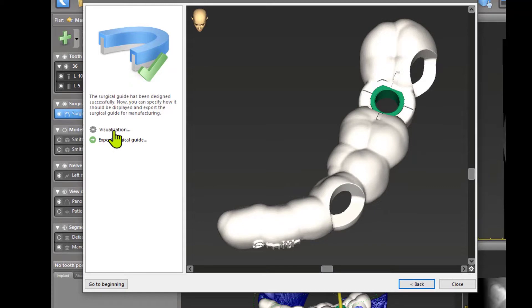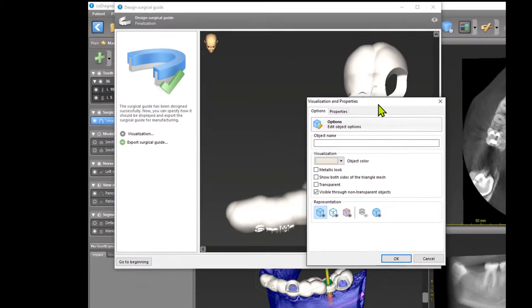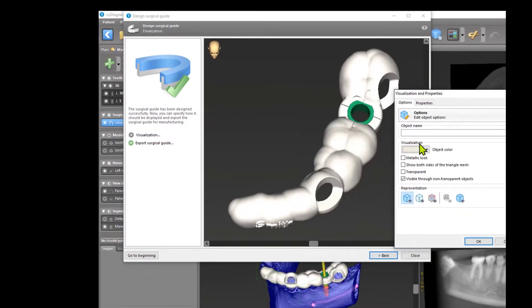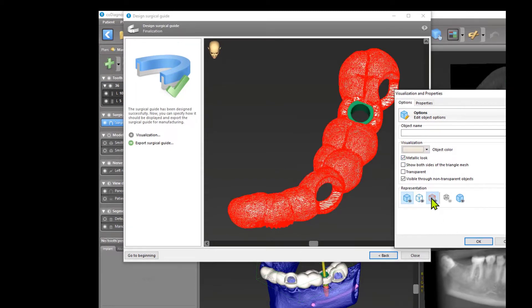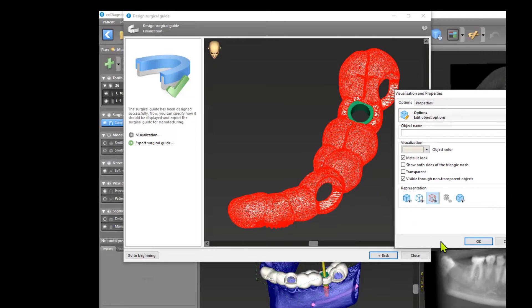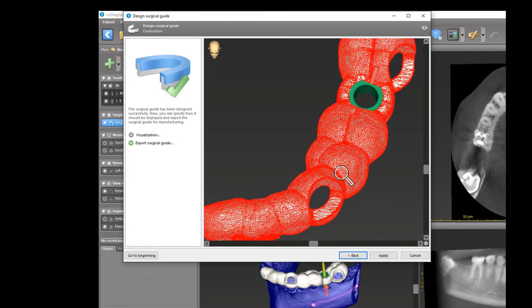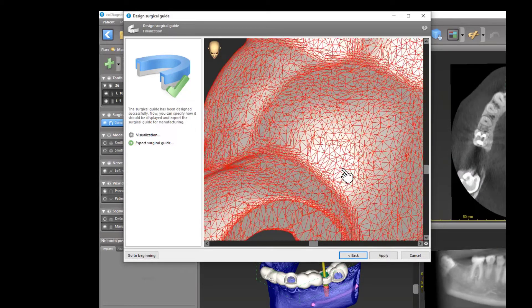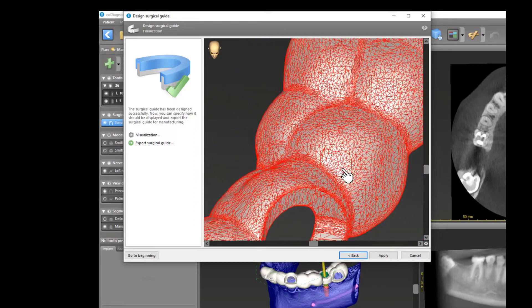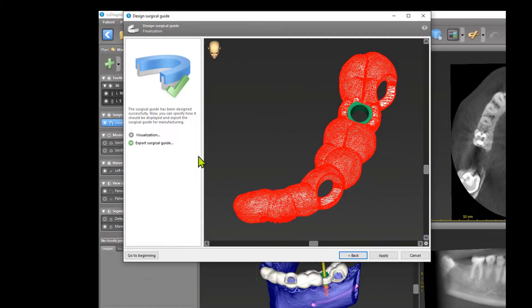If you click on it, you see some buttons. For example, you can give your guide a metallic look or you can activate it here to see the number of triangles and how it is calculated, just to know what is an STL file.